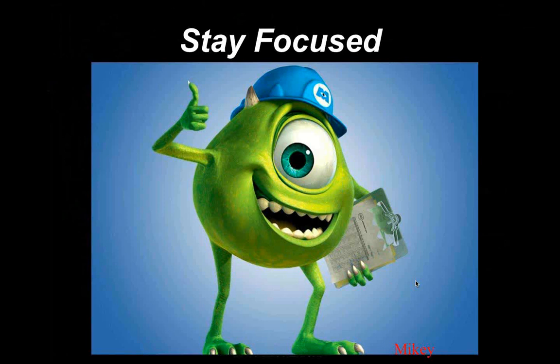I like Steve Burns' comment on that. He says, take your fitting set, take the middle lens, put it on and look at it, and then let that guide you. Or have the patient look straight ahead, then 90 degrees off, look at them from the side, and see, is that a flat, medium, or steep? And that's where I'll start. There's no magic in picking your first lens.